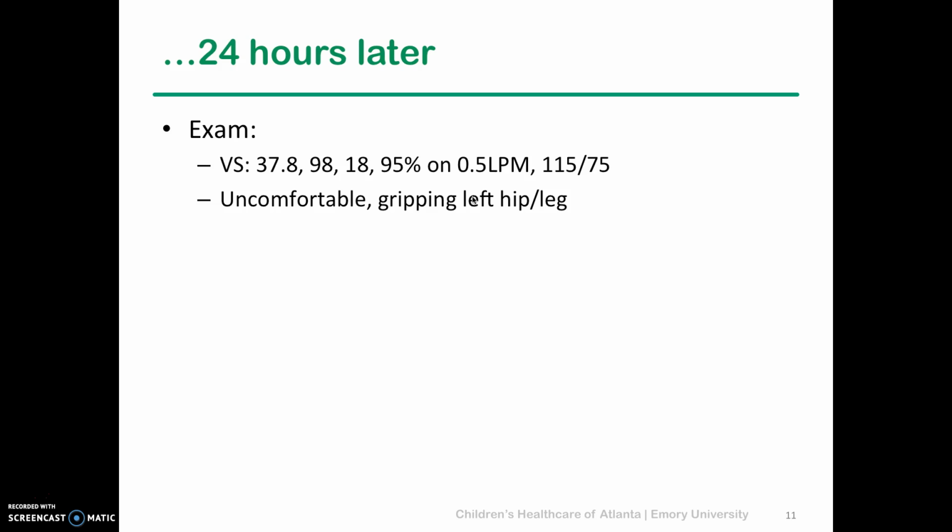Using the same visual analog scale that was used previously to assess his pain, the patient again was asked to use a red marker to mark where his pain was on the visual analog scale.